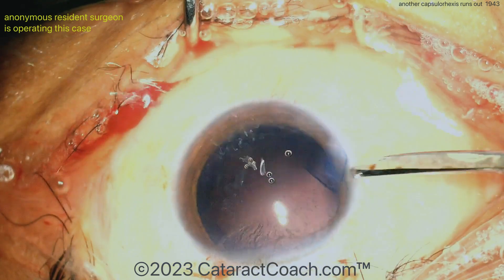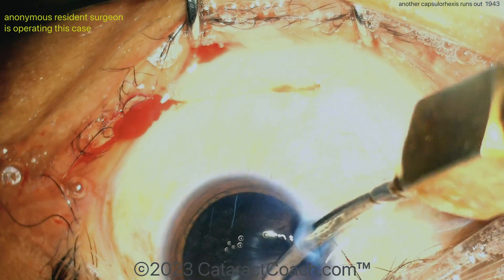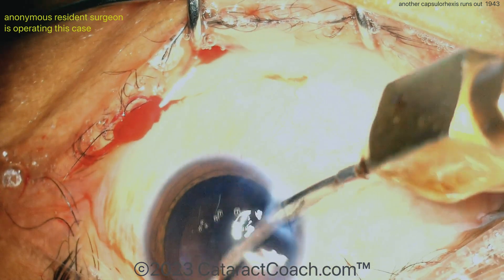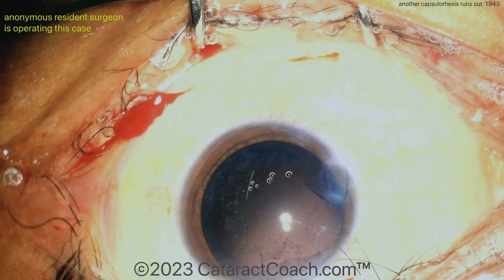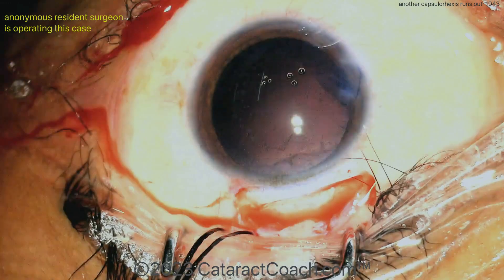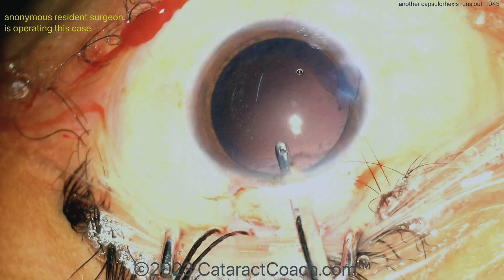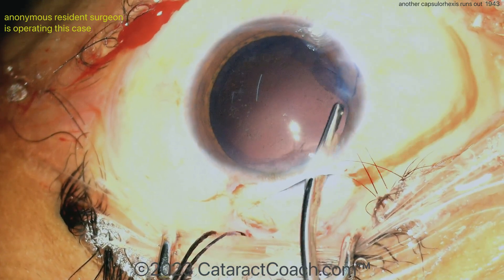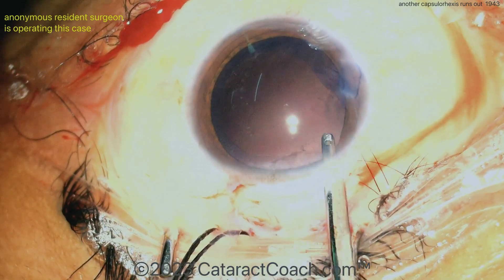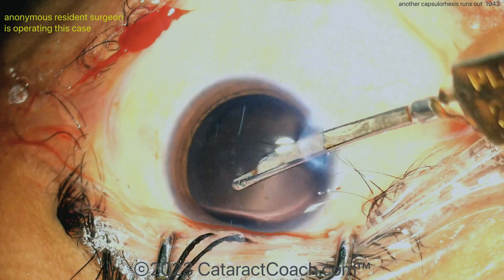You can prevent this. We've shown you two days in a row of these run-out rhexis cases, and both times could have been prevented by using one of the techniques we've been teaching you. You've got to learn the techniques — visit CataractCoach.com, go to the White Cataract Session. There's a whole bunch of videos, including how to do all these techniques, how to rescue this, and how to prevent getting into this situation.